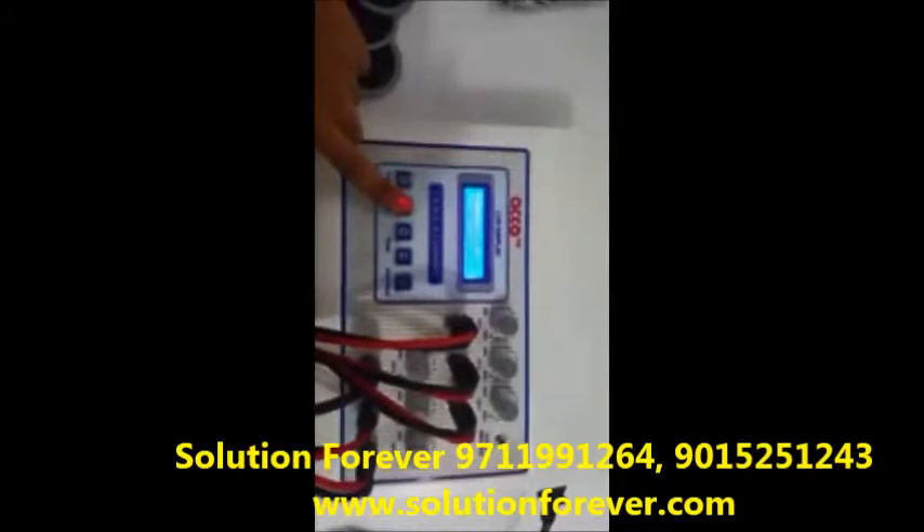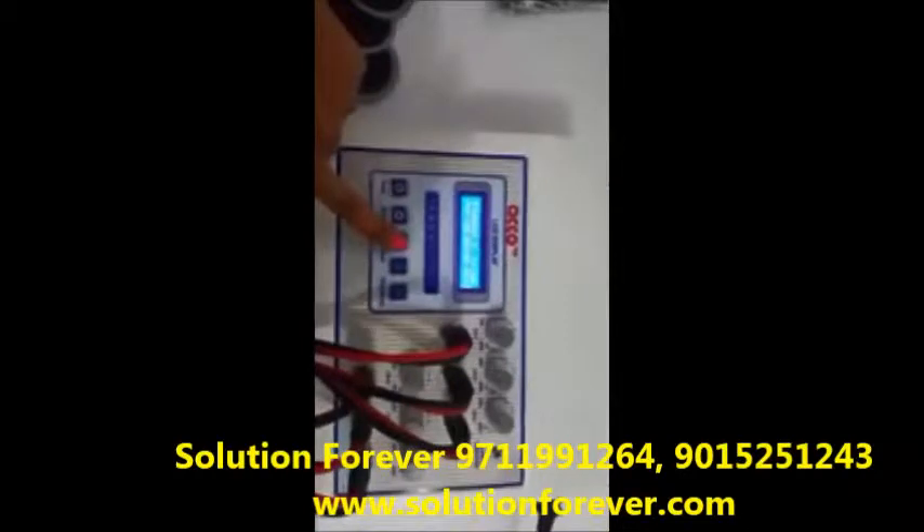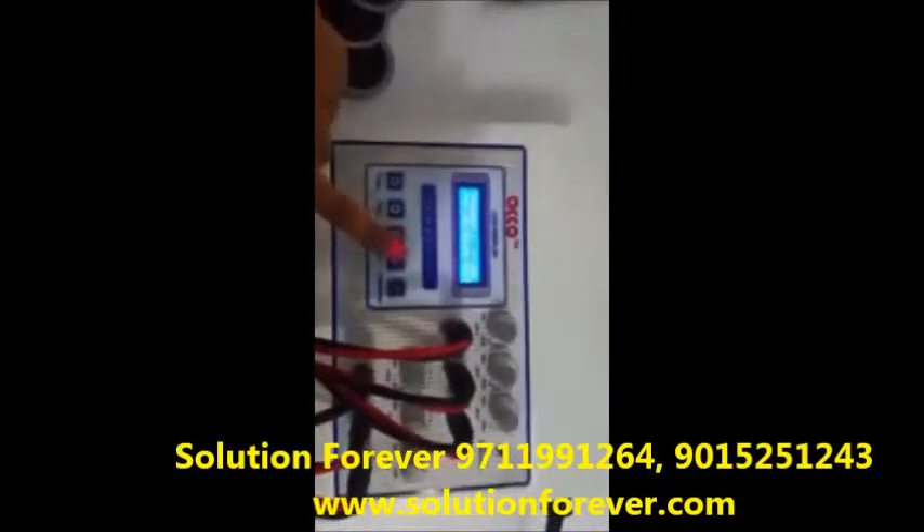Program options include Burst 1, Continuous, and Burst 2. Set the frequency as per your need. Set the timer as per your need using timer up or timer down.